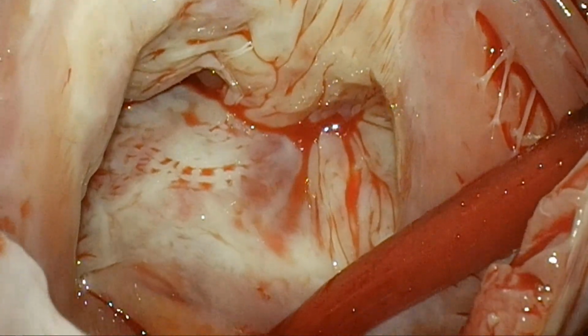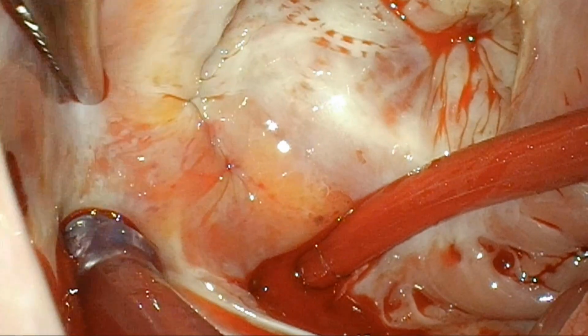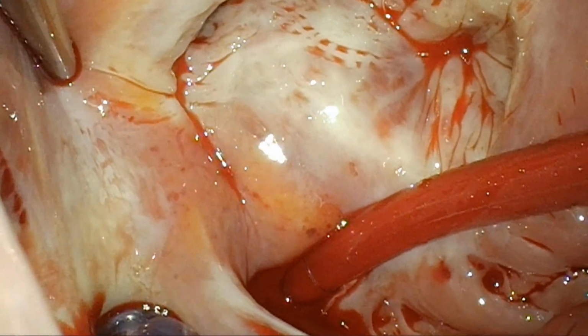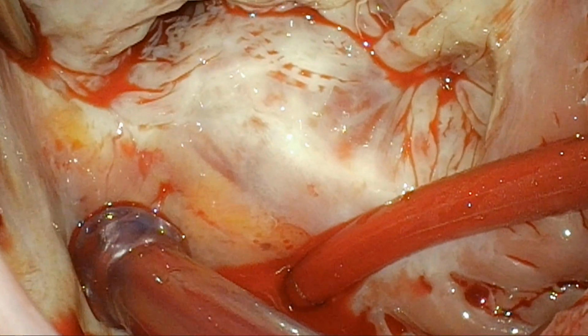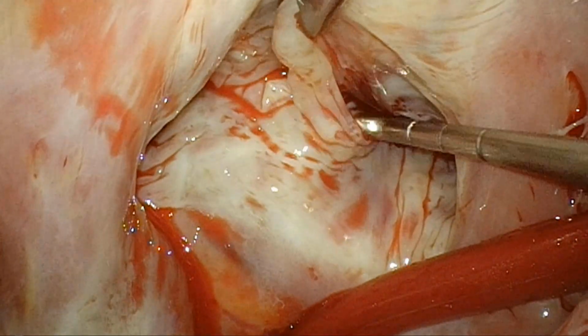That's a surgical video from our library. You can see the coronary sinus catheter. This is the AV node. You can see, sometimes this node is bilobed. It has an AV nodal artery. Sometimes you have to be careful about injuring the vessel. You should never get close to any yellow structures in this area while putting the annuloplasty sutures.